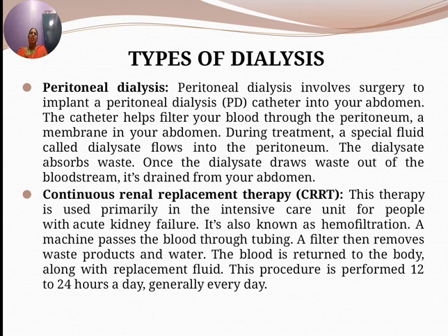The second method is the peritoneal method. What is peritoneal dialysis? Peritoneal dialysis involves surgery to implant a peritoneal dialysis catheter into your abdomen. So you need a surgery.